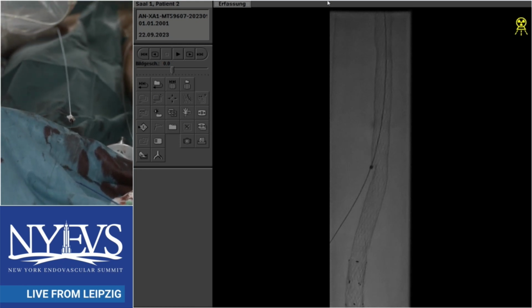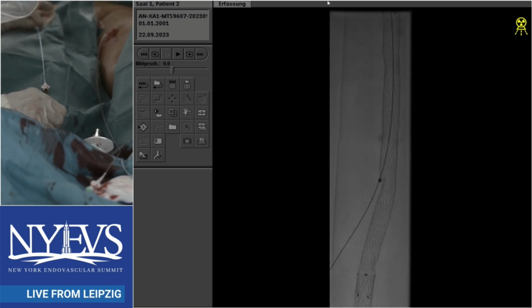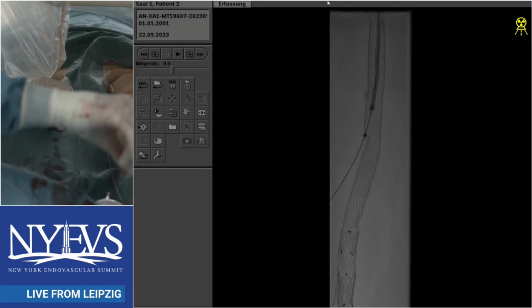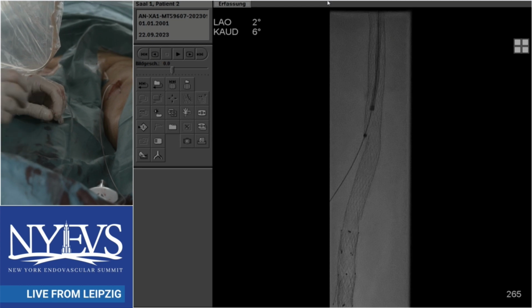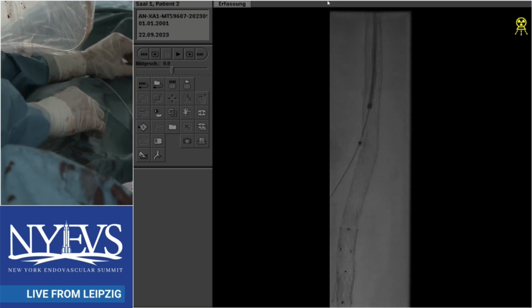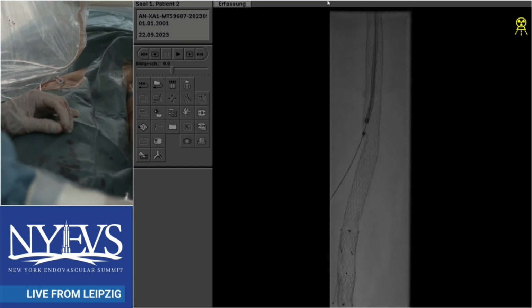Our experience is, if it's that difficult at some point already in the proximal part of the stent, you may encounter several other areas where it's similarly difficult, and you have to overcome them again, and it may also be difficult from retrograde. So in these kinds of cases I prefer, in the end, several retrograde approaches, which is absolutely no problem here.